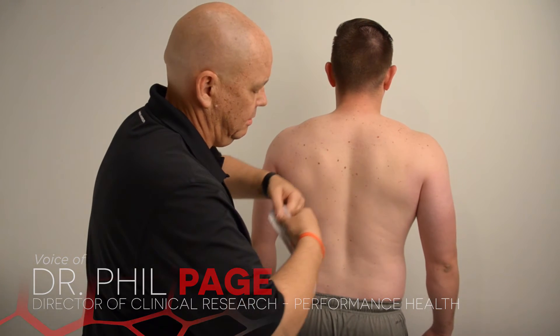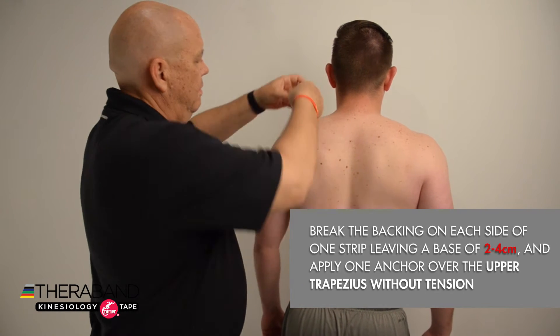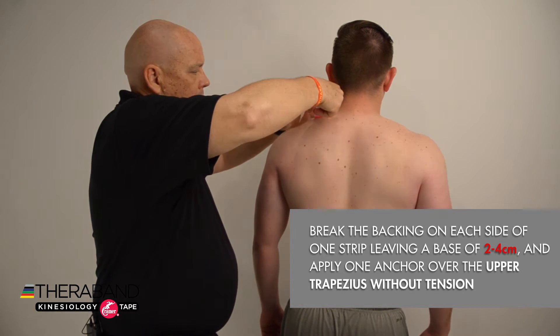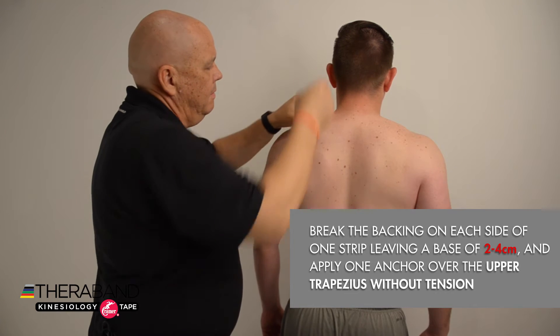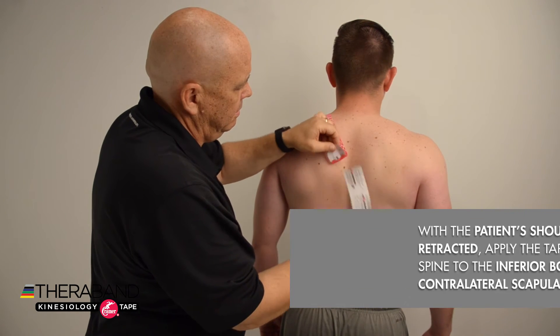I'm going to apply one anchor without any tension over the upper trapezius on one side of the body, and then remove the paper backing down to the other anchor and have the patient gently retract their shoulders and get into a better posture.